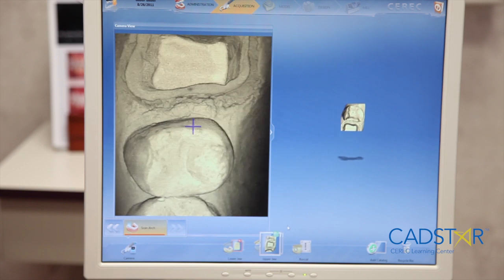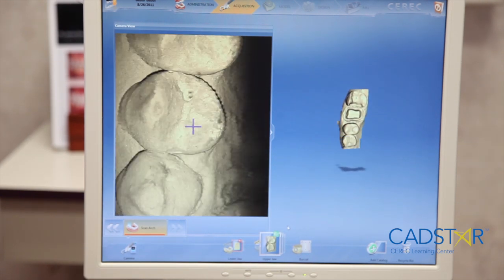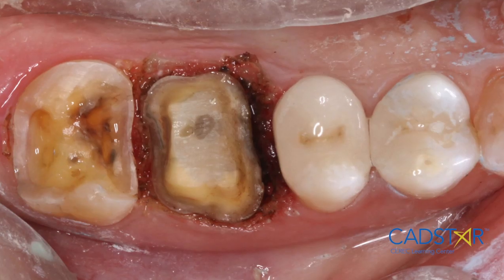meaning my restorations are dropping in with very nice margins, the occlusion is on, and my proximal contact firmness is the way I like to see it. It works effectively, and you will find that the optical impression has been significantly simplified.